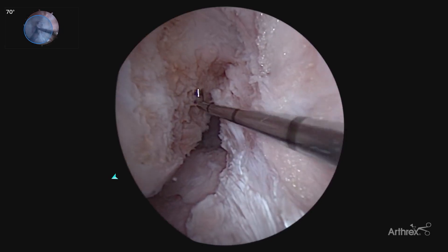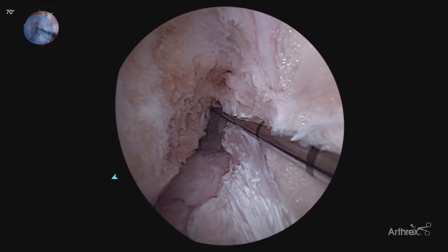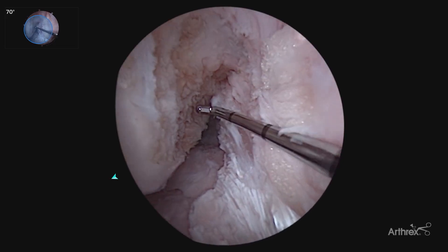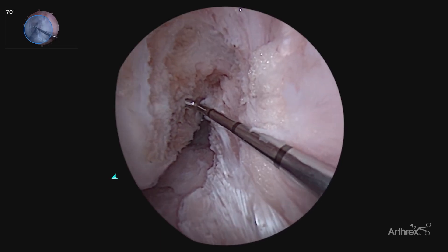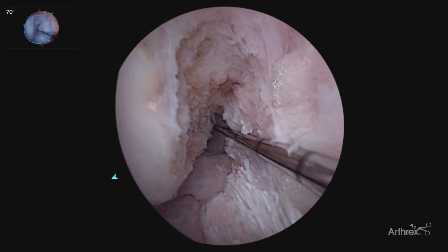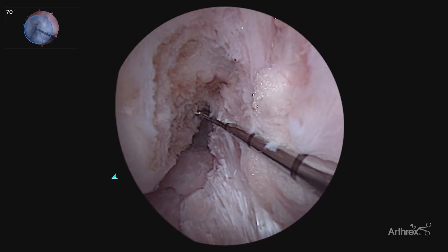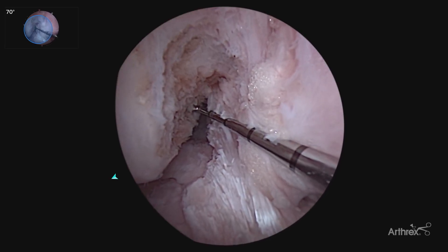Now you have much more accurate footprint assessment and much more accurate tunnel placement. You're able to visualize the back wall, as well as the entire anatomy of the ACL. As we've published previously, utilizing the 70 degree scope and now the panascope view allows us, as we're drilling our femoral ACL tunnel, to have accurate tunnel placement, as well as accurate depth — being able to measure both the front and the back of our tunnel to assure the appropriate depth so we don't have any bone plug and graft mismatch.